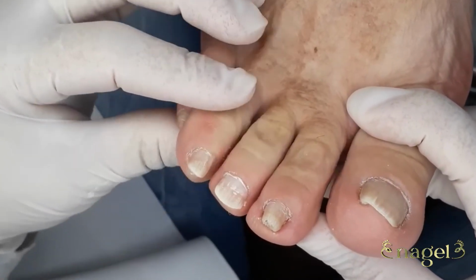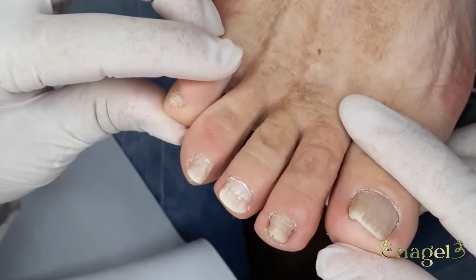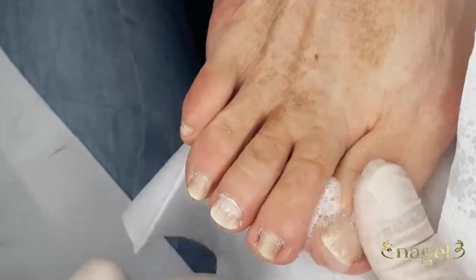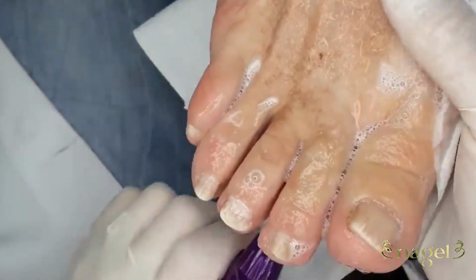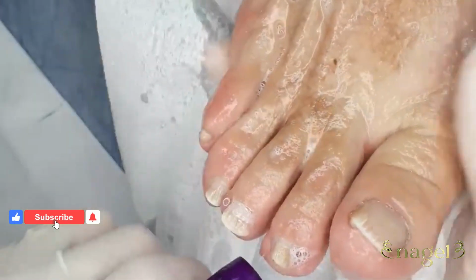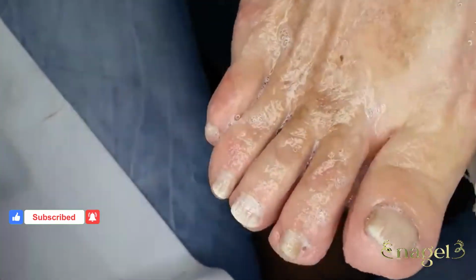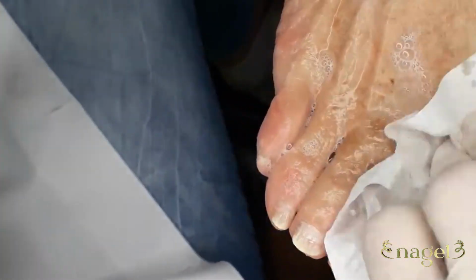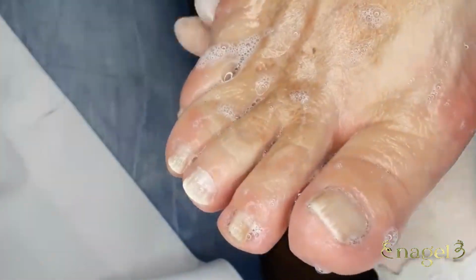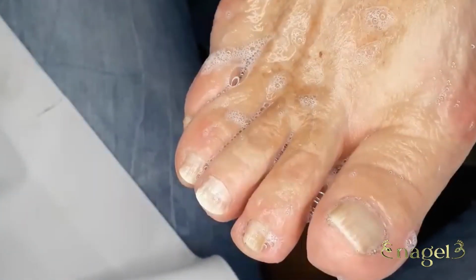Ready to dive into this care with love and attention? Let's go! We'll start with my mom's right foot. The main issue here is an ingrown toenail that's causing significant discomfort. She told me she's been feeling pain in the toe, especially because the nail is pressing into the surrounding skin, creating mild inflammation. This is something I've been monitoring for years, and as she mentioned, she hasn't had a procedure with me since December, which has caused the nail to become more curved.